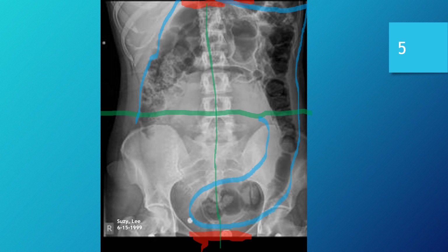All of this area here, of course, is bowel gas and bowel stool, and it has really obscured some of the other soft tissue structures within the abdomen. However, there's not a lot we can do about that. If anything, this particular patient's probably in a pretty good deal of discomfort because of that fullness. But that's probably part of why they're getting an x-ray, to determine what's going on there. But yes, internally we do have some interference from that bowel gas and stool artifact.